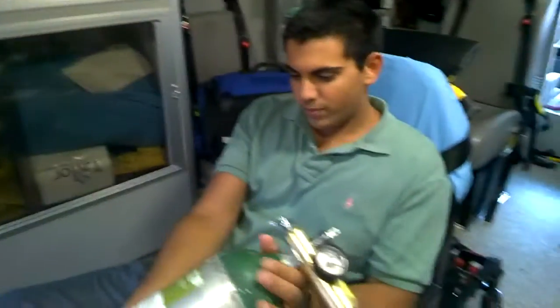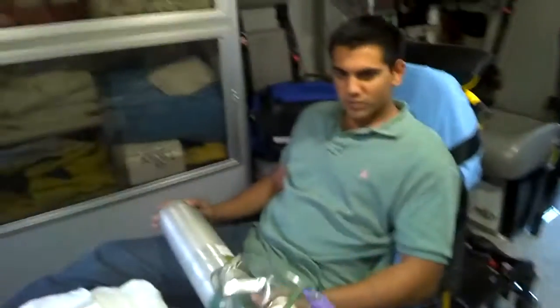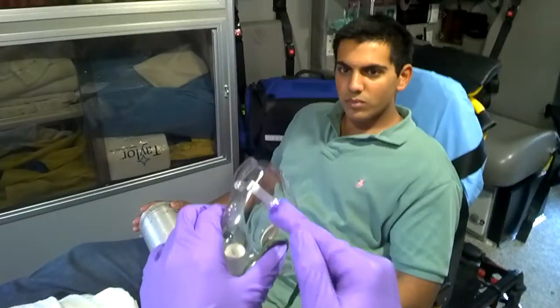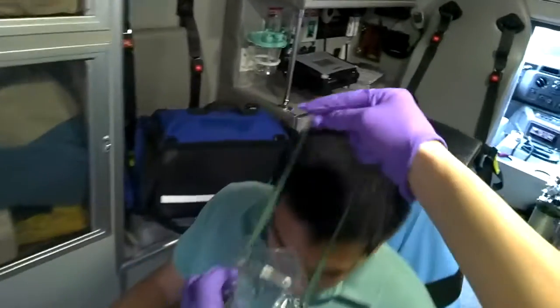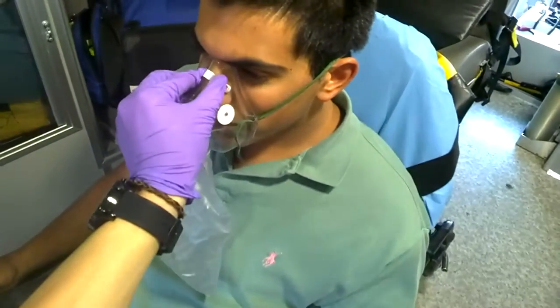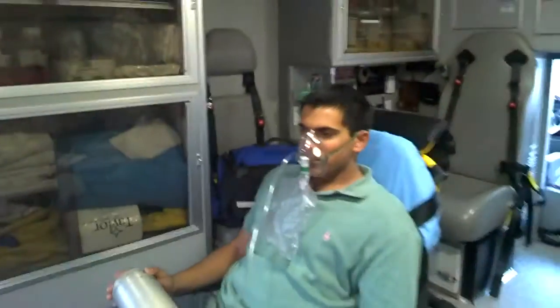But you want to hold on to that? Once it gets full, then you want to put it on the patient. So these rings here, you want that on top on the nose. And you want to just pinch it right here. And that's how you give a non-rebreather.